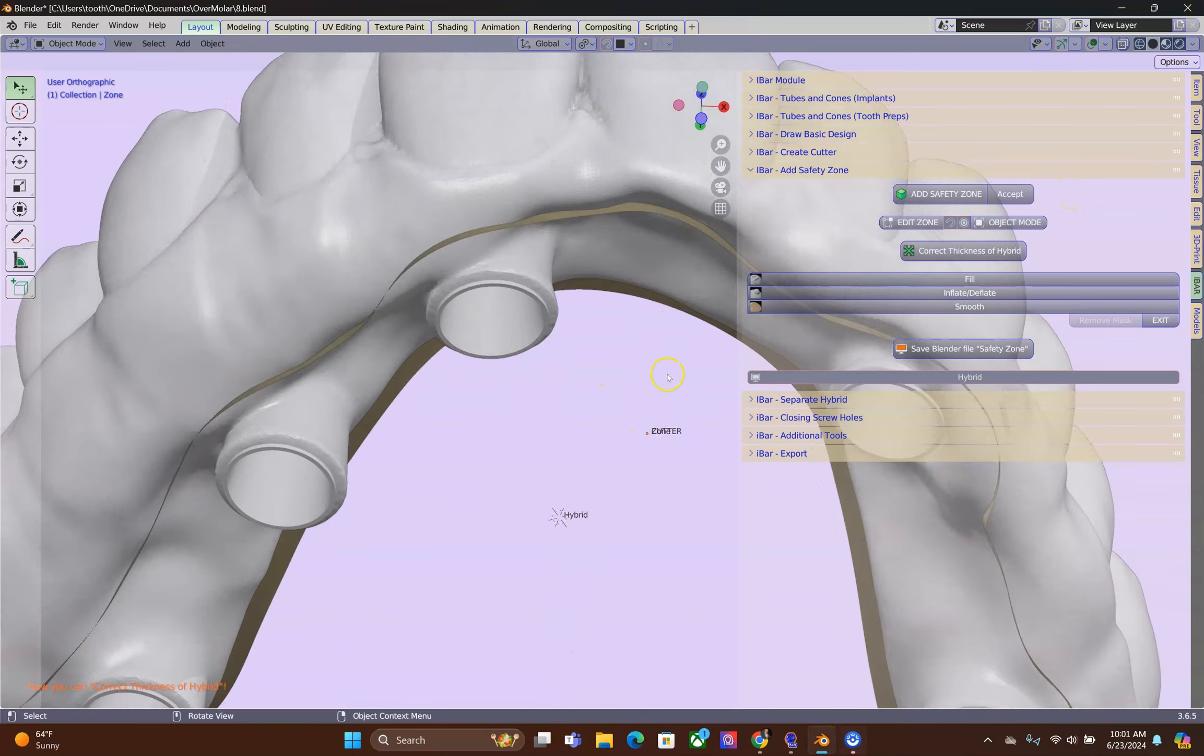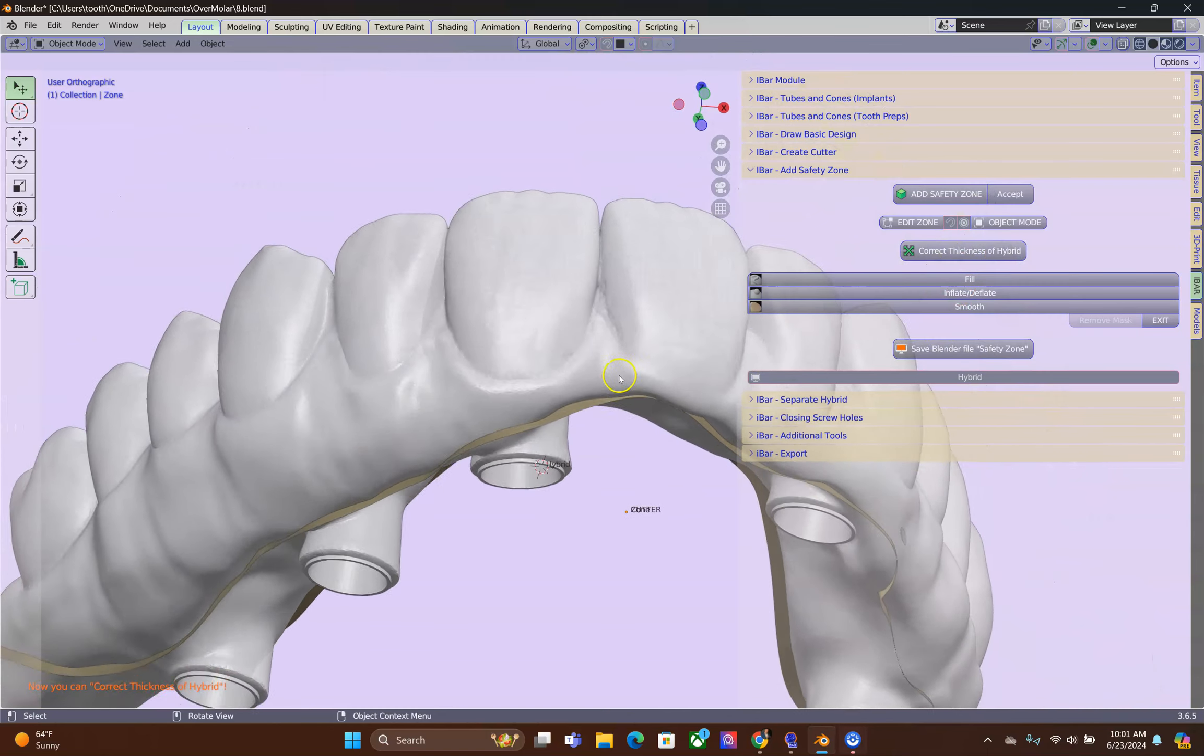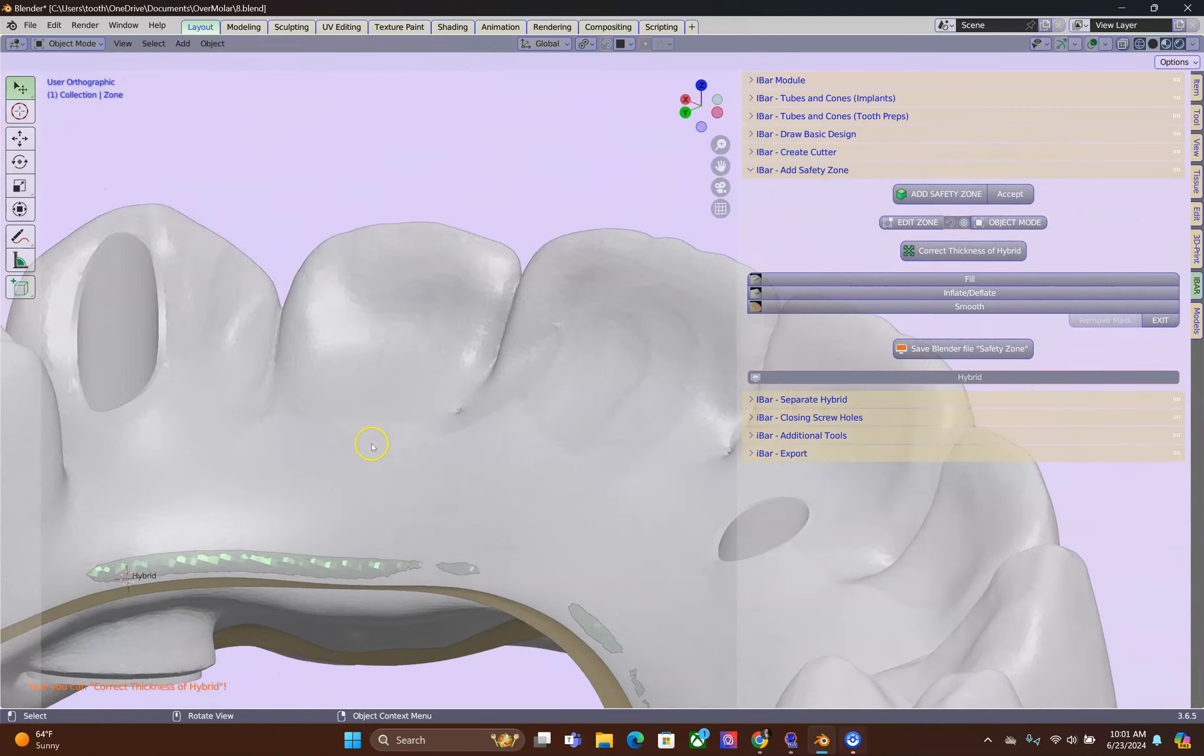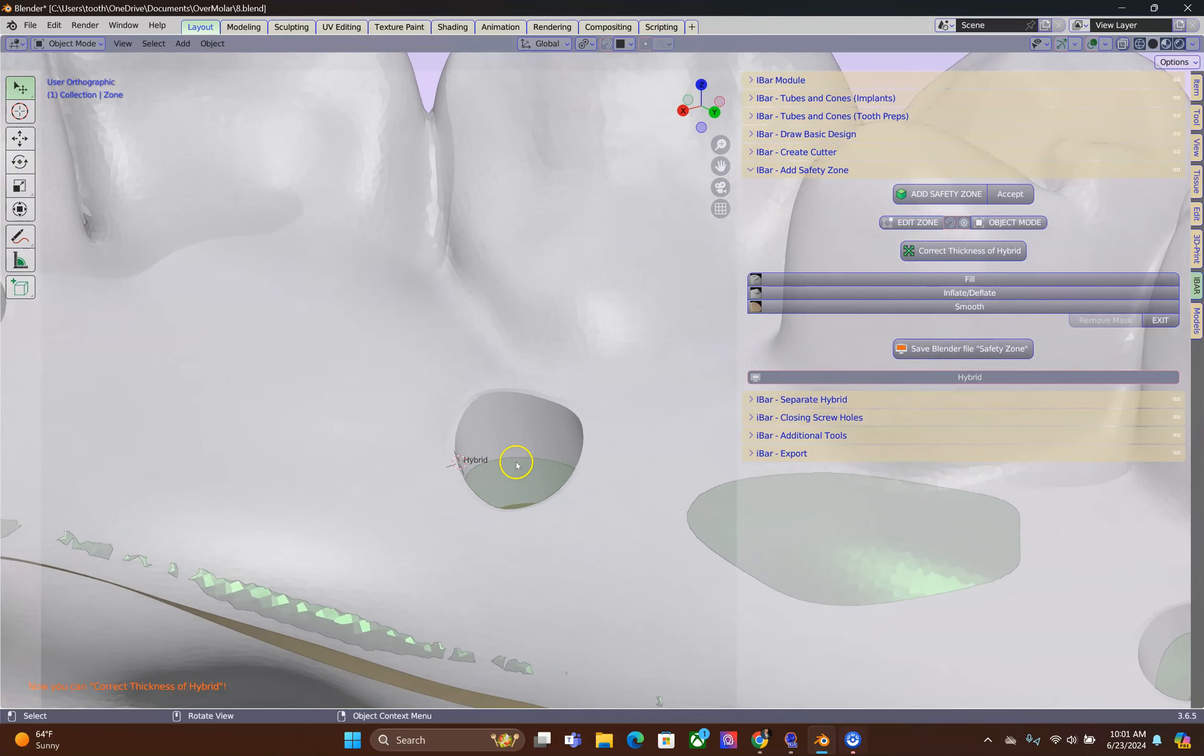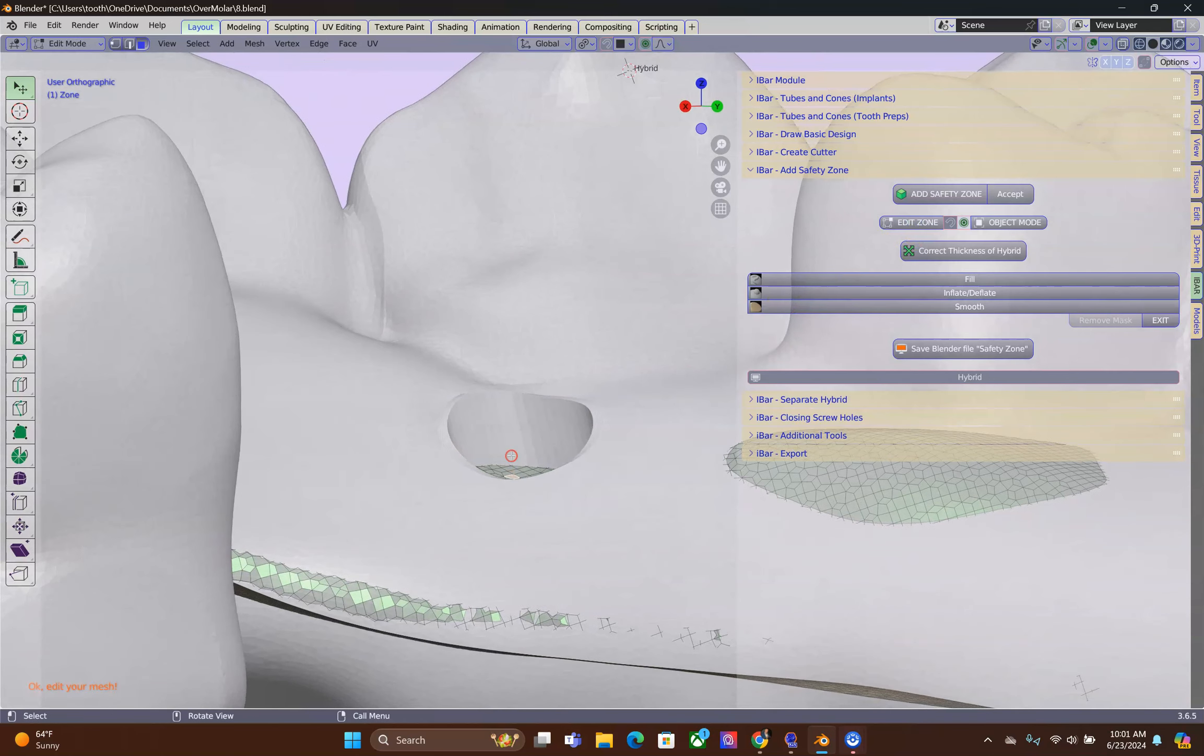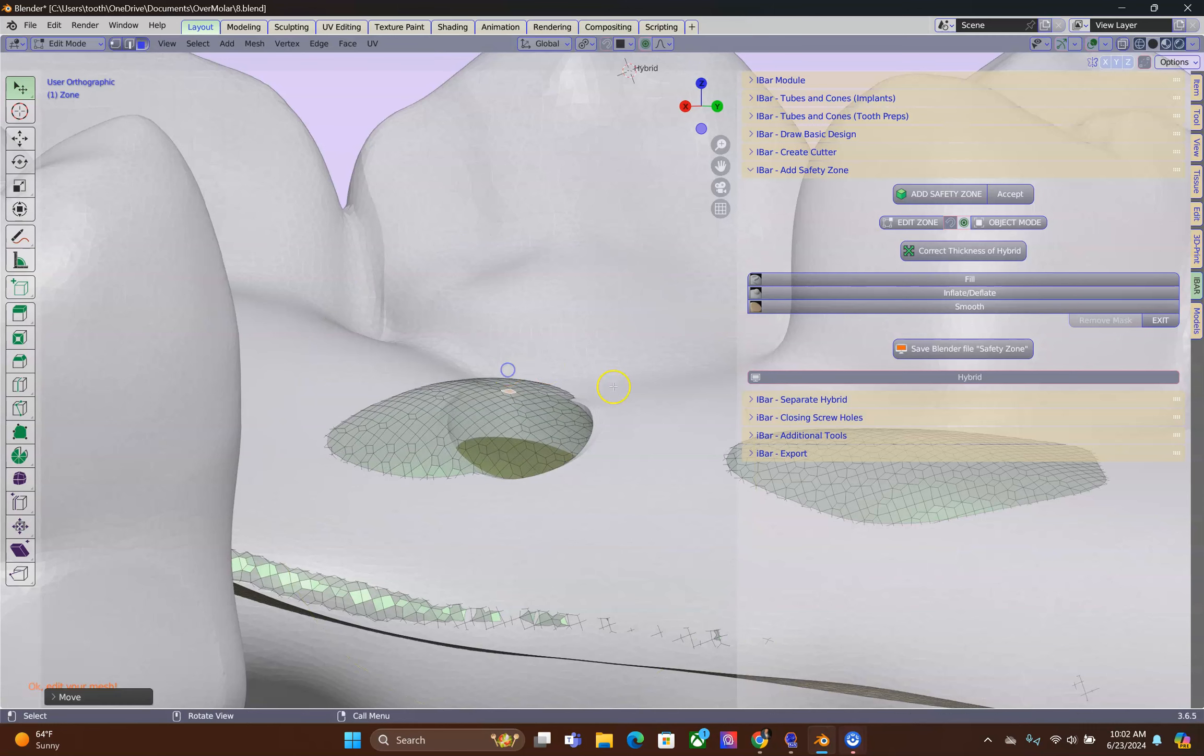Now, before we click on Correct Thickness, make sure that your green zones are underneath the screw holes. If, for any reason, the green zone is up here, please move this green zone down.